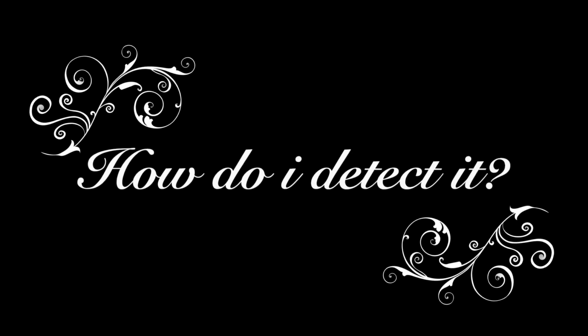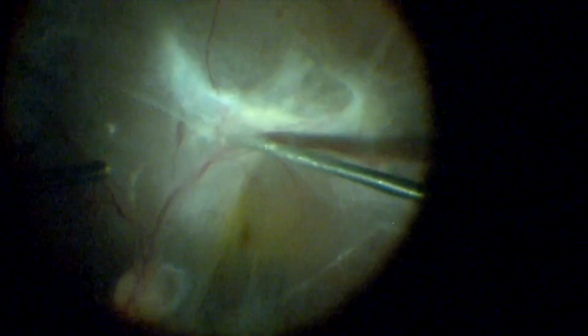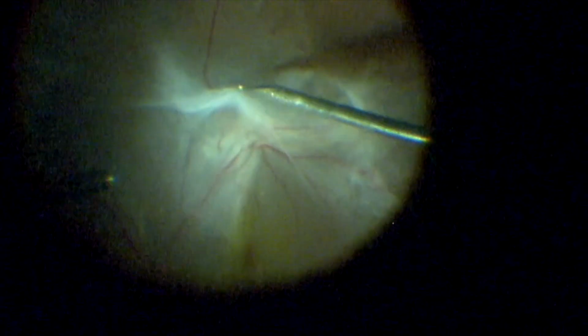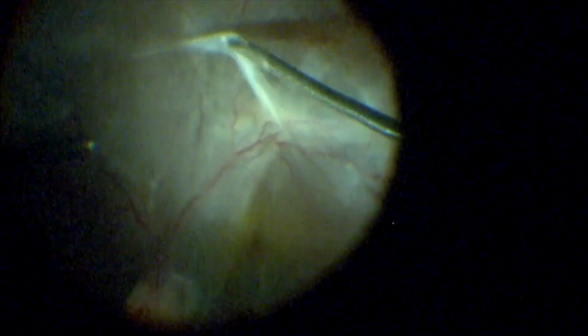Here you can see that the secondary membrane is generally seen to be extending far wider than that what is obviously seen clinically. How do I detect these membranes? When you see that you are not able to access these membranes, you would know that there is a presence of the secondary membrane. And using one of the instruments like a pick, you can identify the secondary membrane and then dissect the fibrovascular tissue clear from the retina.